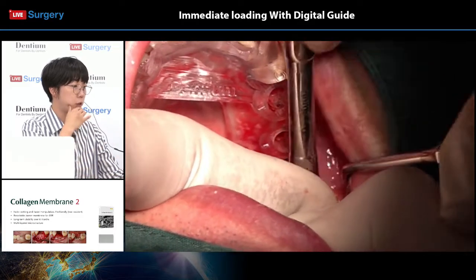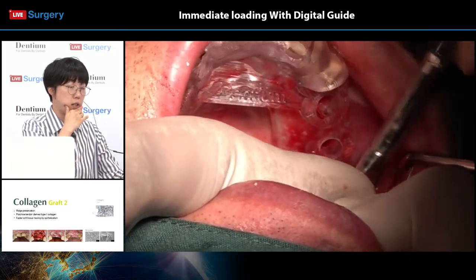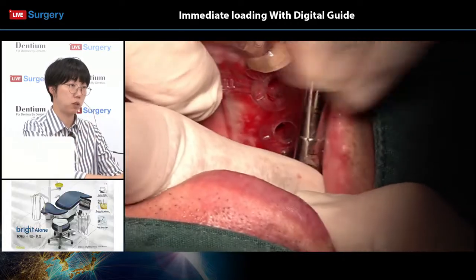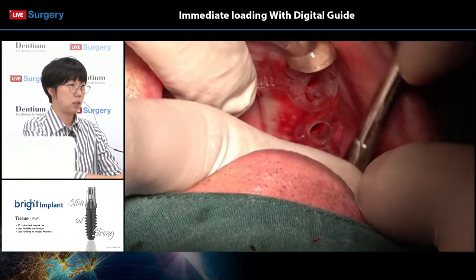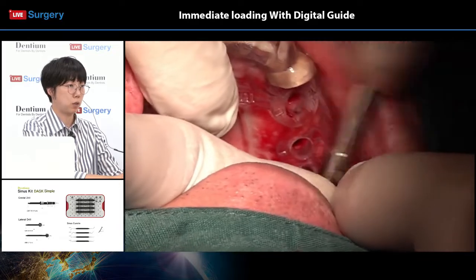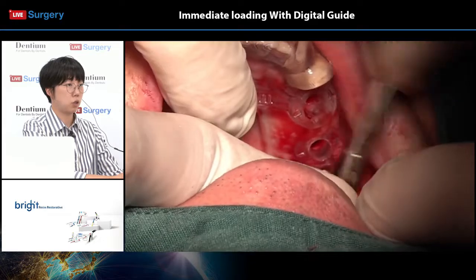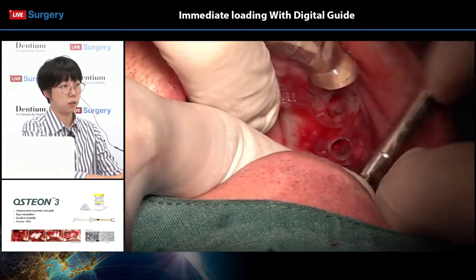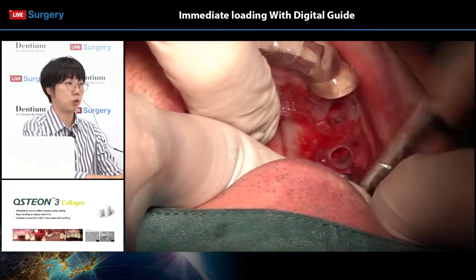Now, before the surgery, the surgeon can analyze the bone density through the CT scan, and keeping that in mind, make adjustments in the drilling sequence to allow for sufficient initial stability during implant placement. But the situations can always differ from what we've planned to do, so making the right decision between each step is very critical for promising outcomes of your implant surgery.